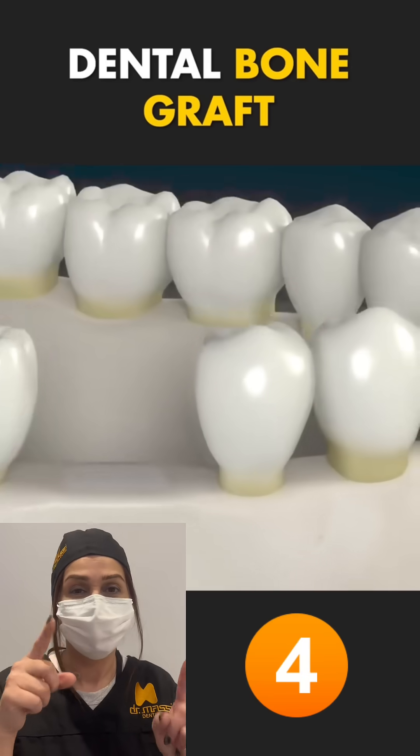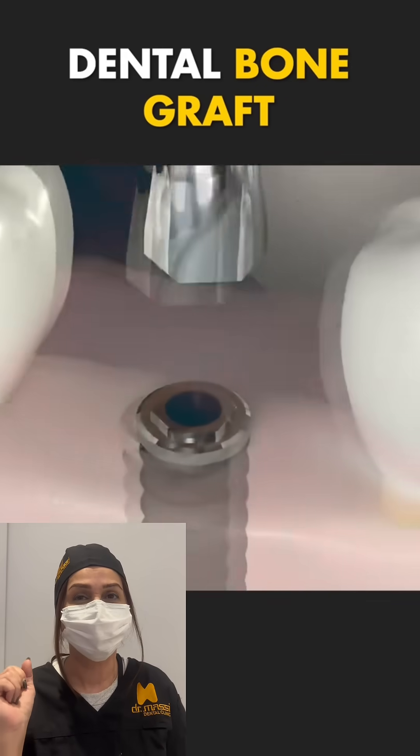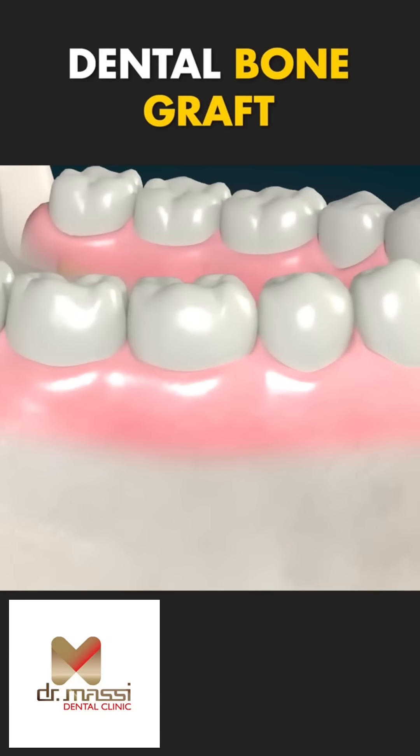Step 4: Over the next few months, your bone gradually integrates with the graft. This sets the stage for future dental implants or other treatments.